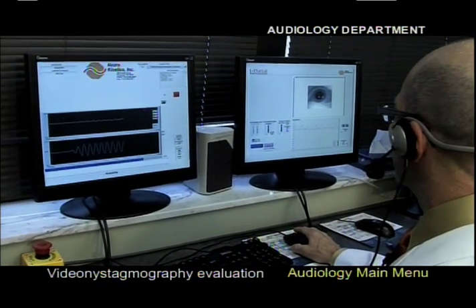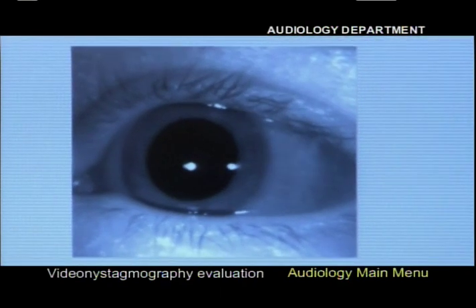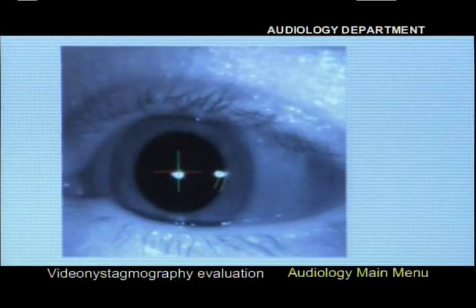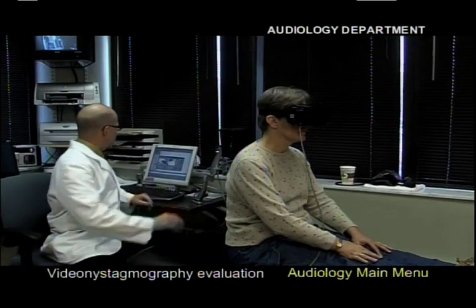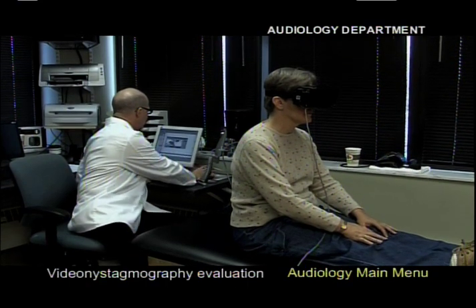If not for this link, simple activities like walking or checking traffic would be very difficult because your vision would blur or bounce with each head movement. The next procedure the audiologist performs is position testing.